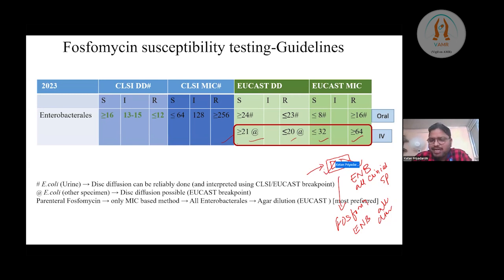You need not restrict your disk diffusion testing only to urine isolates. The breakpoints Saru has already told are what we will recommend and use for interpretation.